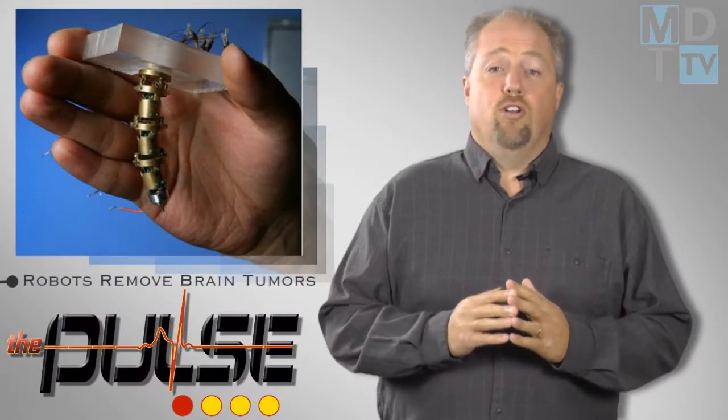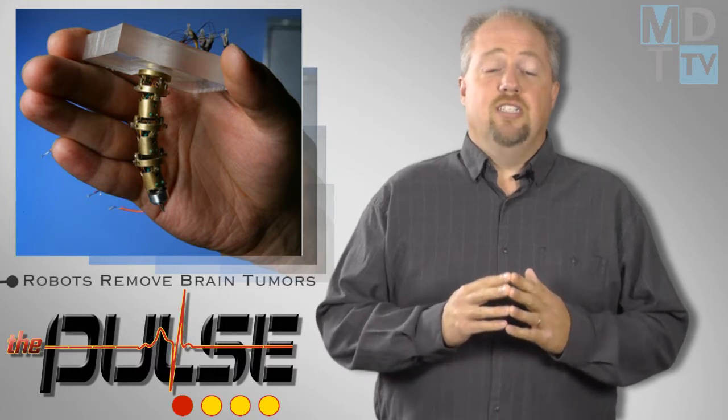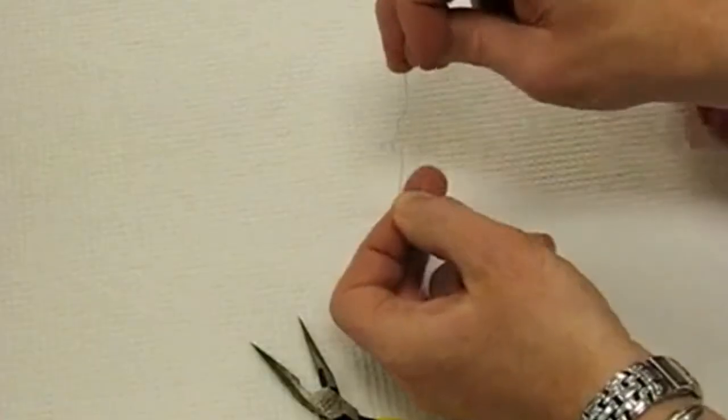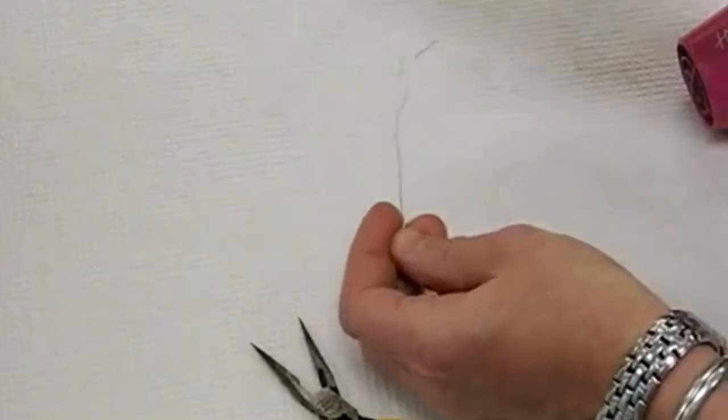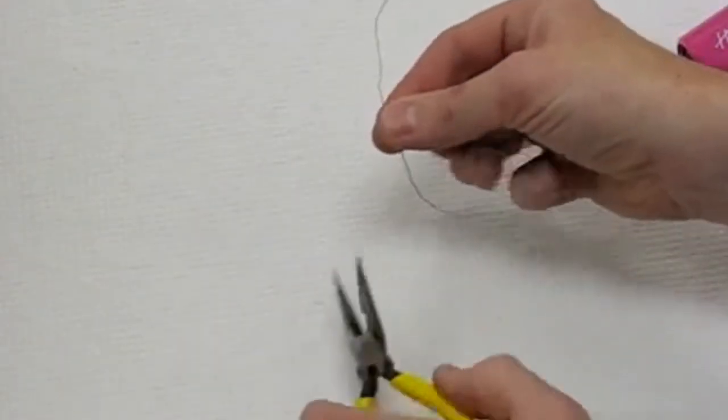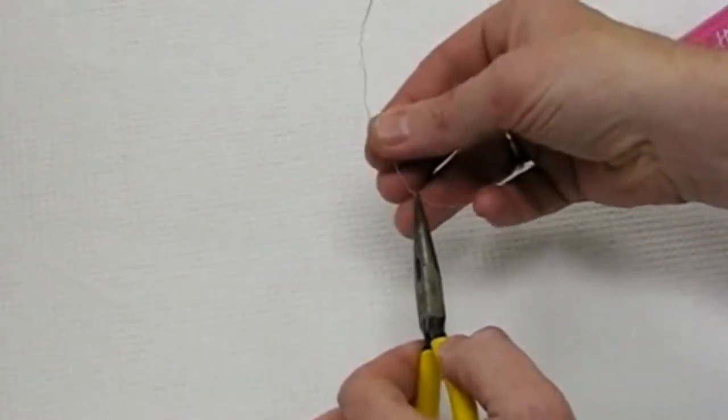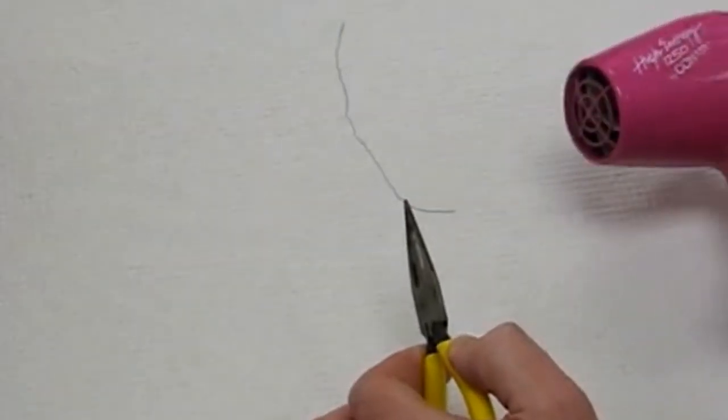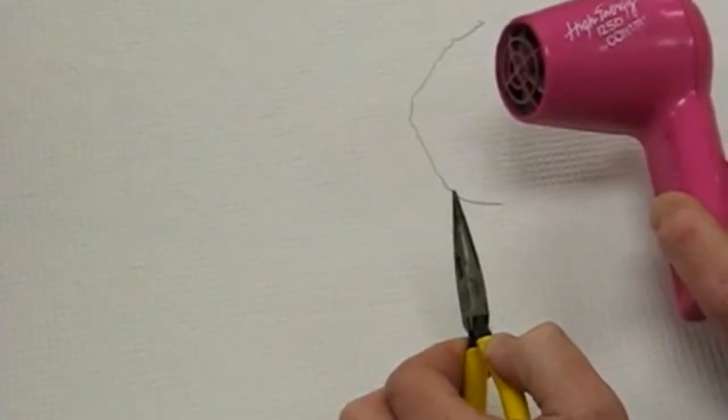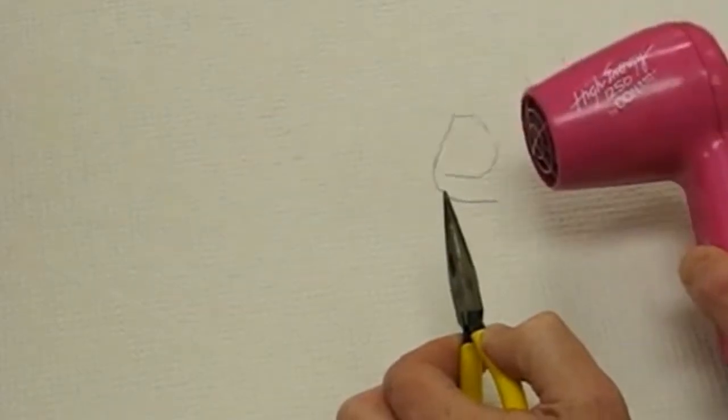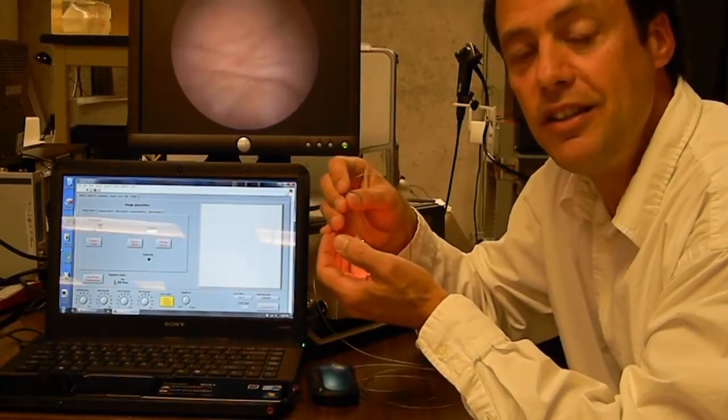Engineers are teaming up with neurosurgeons to develop technologies that enable less invasive image-guided removal of hard-to-reach brain tumors. Their tech combines novel imaging techniques that allow surgeons to see deep within the brain during surgery using robotic systems that enhance the precision of tissue removal.